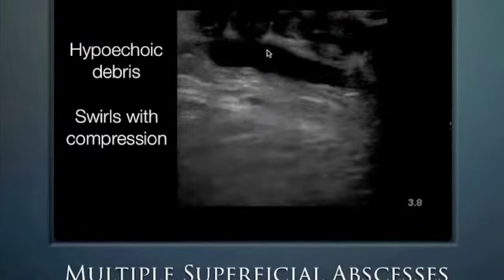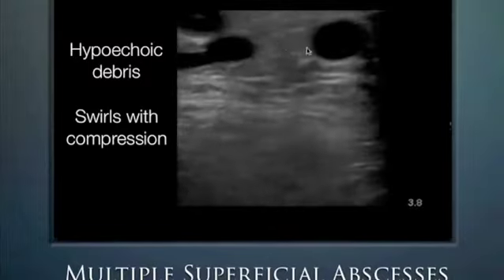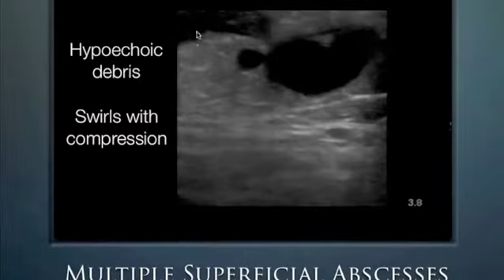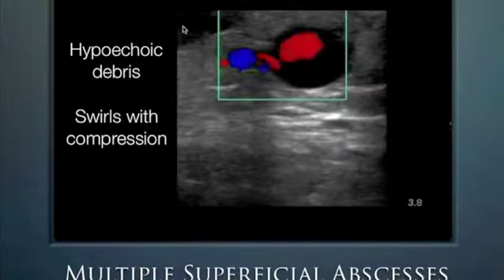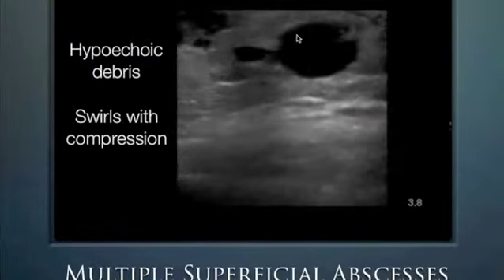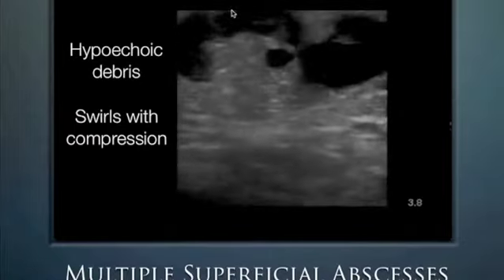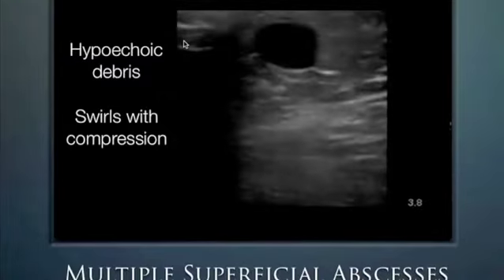And so this was a very tricky one. We wanted to drain it, but stay clear away from the vascularity and just get into the abscess only. And we can see this network of abscesses here as they're going along, and with various areas of vascularity that we're trying to stay away from. And ultrasound is good because it helps us really focus ourselves on staying with the compartment of the abscess and not getting into the vessels.